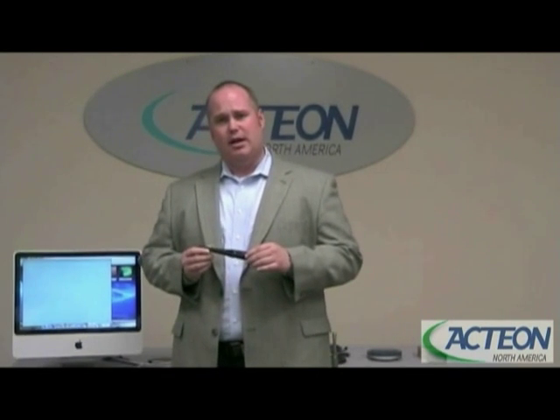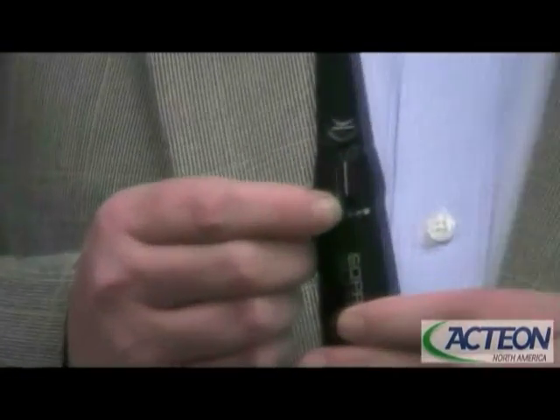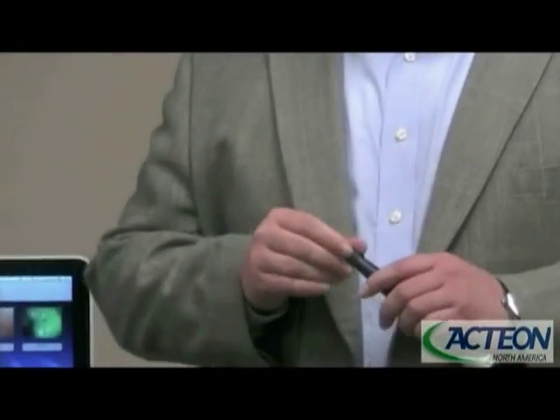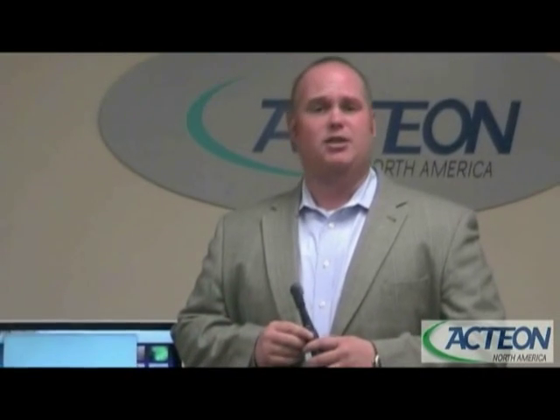The SoProLife, as I mentioned, is the exact same camera as the 717 First. We do make one addition: this blue dot is what we call the SoPro Life Mode. SoPro Life Mode is designed to be used with these black caps, which come inside the camera box and ship with four of them. They are autoclavable and not disposable, so don't throw them away at the end of the procedure.